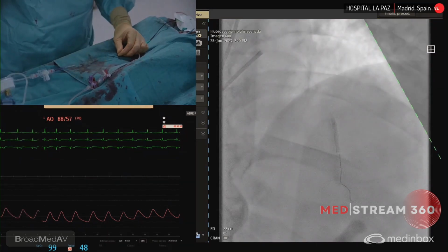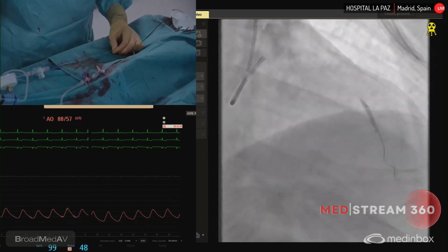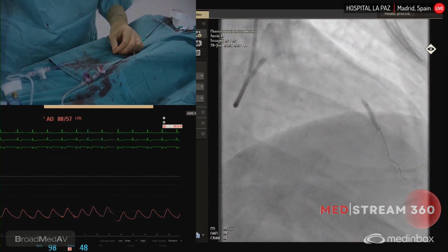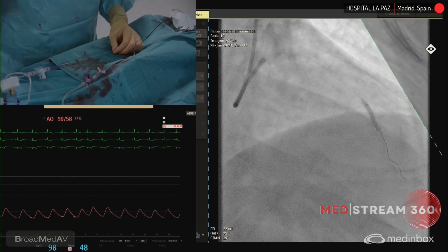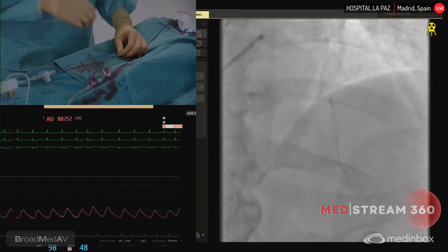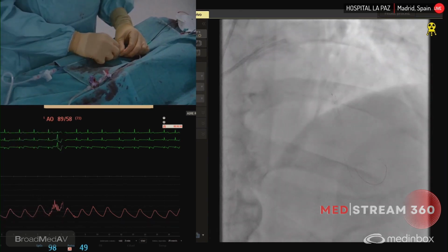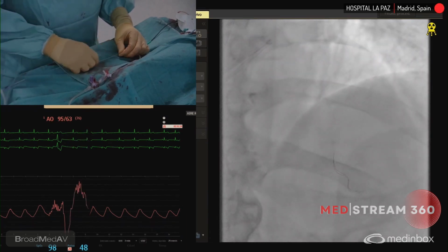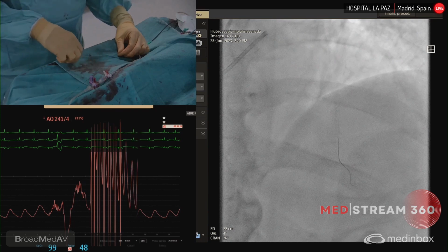As there are no questions: as you have in place a pressure wire, would you be confident if the result of the pressure wire normalizes after stent implantation, or do you prefer guiding with intracoronary imaging? It's a very good question. There are some trials about the optimizing of the stents with pressure wire, but the results are not clear.